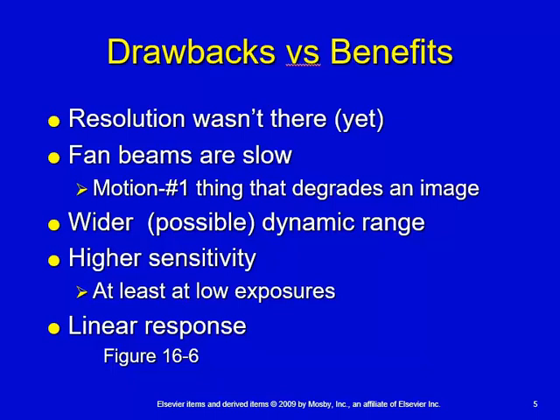But if you look at figure 16-6 on page 299, you'll see what I mean by at low exposures you may have increased sensitivity. The response to digital imaging is a linear response. We still use that H&D curve to represent contrast and density and our image receptor speed.